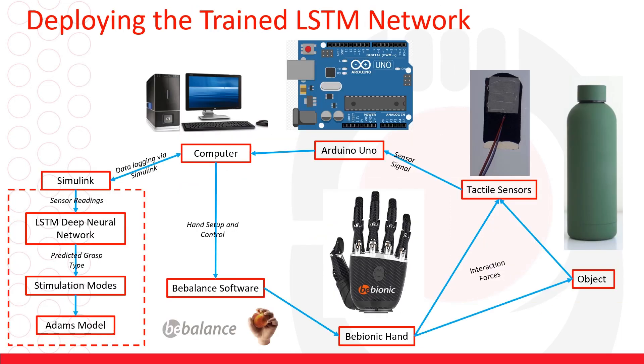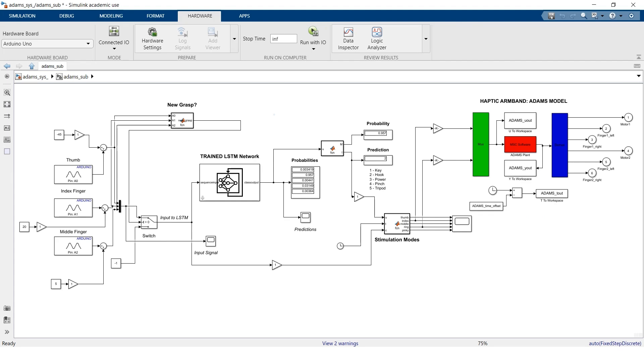With the network trained the next stage is to deploy the trained network using real-time input and we produce a real-time output to an Adams model of the haptic feedback device. This is the structure of the Simulink model that we're using.